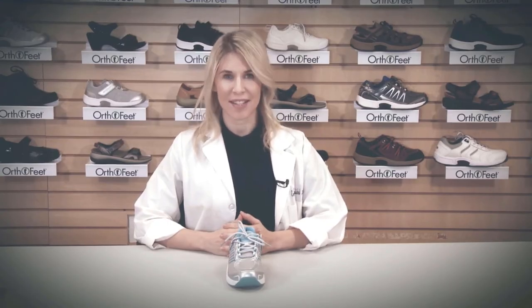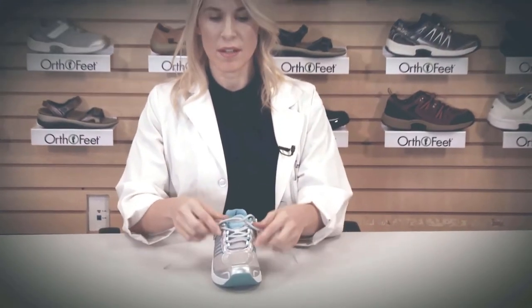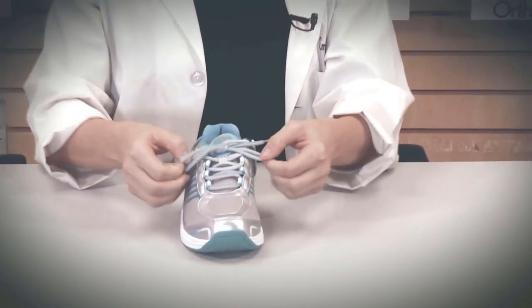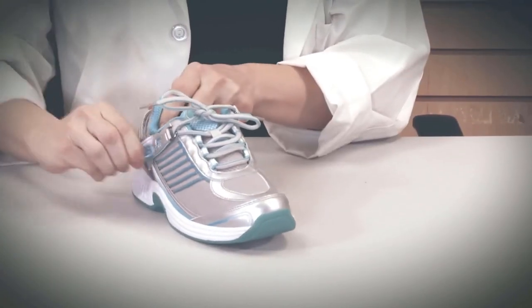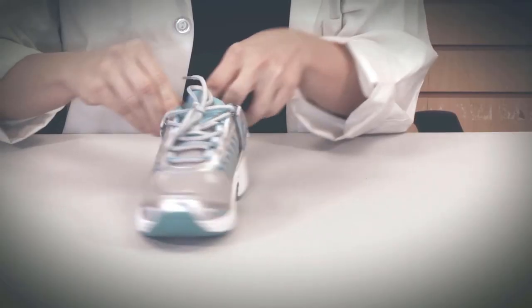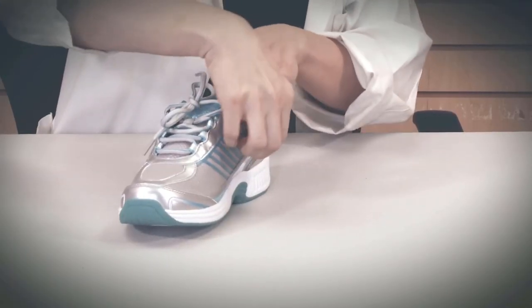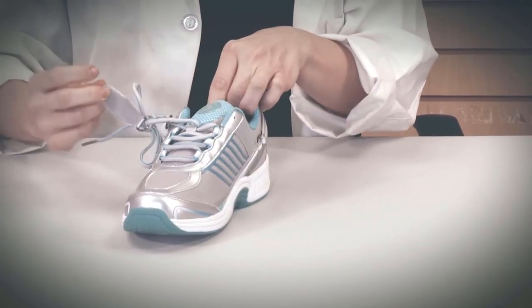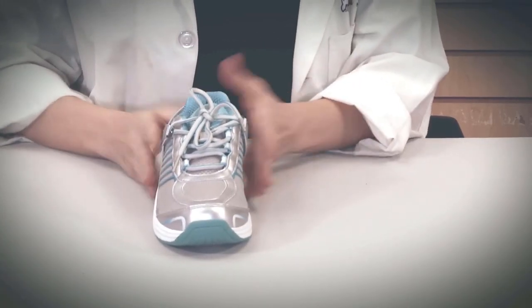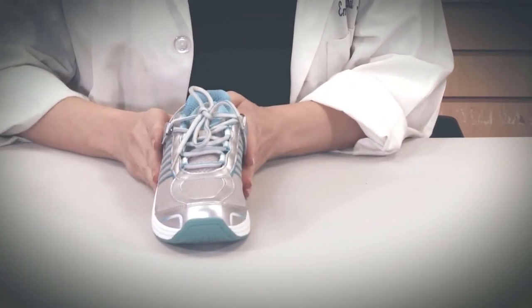Another innovative feature of OrthoFeet shoes is the Tileus Lacing System. This provides the aesthetics of the shoelace with the benefit of the Velcro snap. You can open and close the Velcro snap from either the outside of the shoe or the inside of the shoe, providing ease of access for those who may have trouble bending down or those with arthritis.